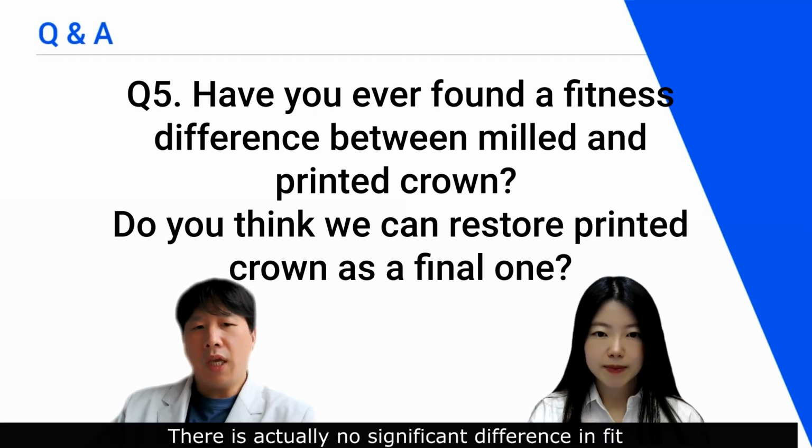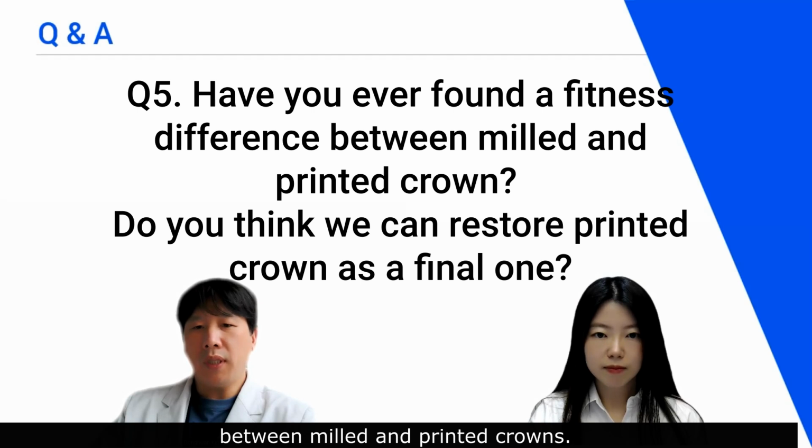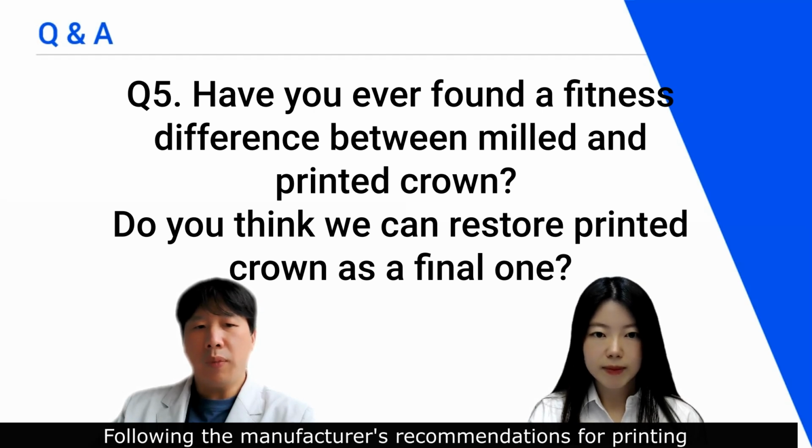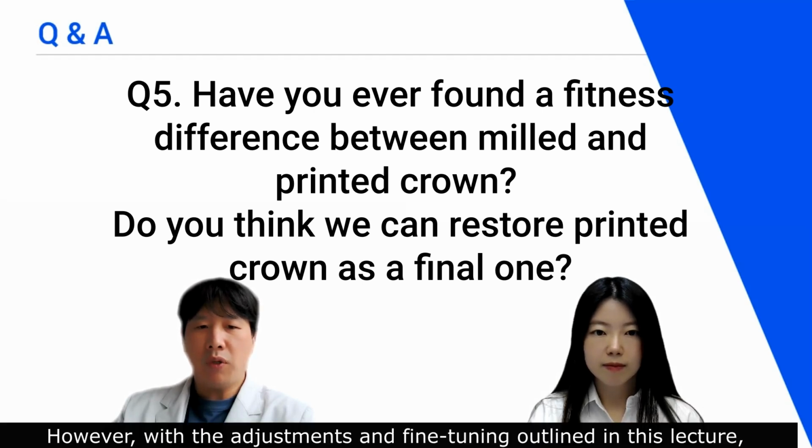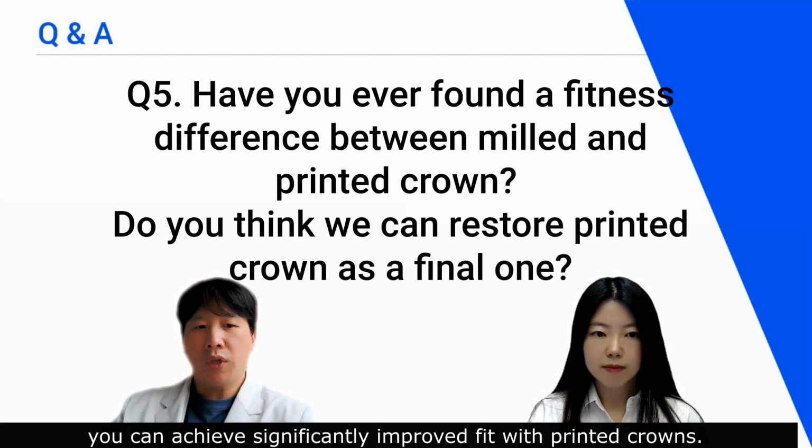There is actually no significant difference in fit between milled and printed crowns. Following the manufacturer's recommendations for printing might not yield a product suitable for use as a final prosthesis. However, with the adjustment and fine-tuning outlined in this lecture, you can achieve significantly improved fit with printed crowns.